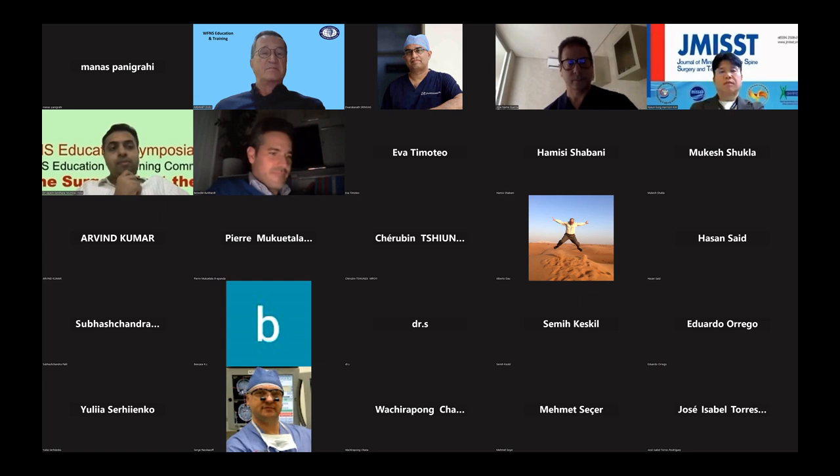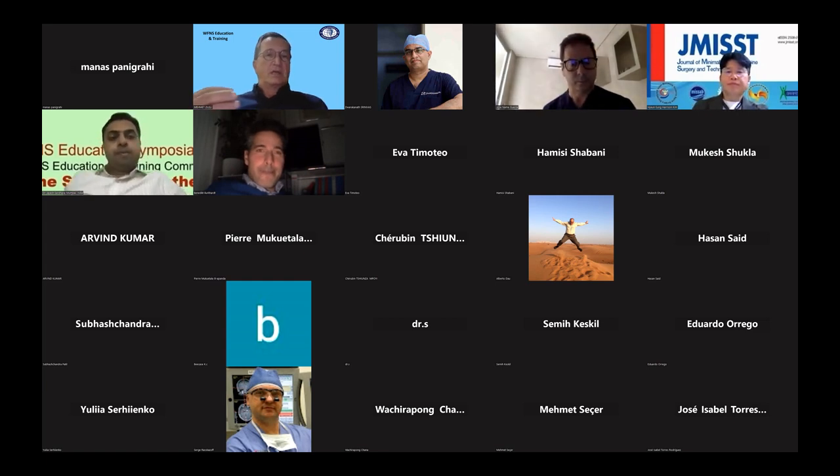I must mention that the drill bits used for this endoscopic surgery, for fusion or for compression, are very expensive. They are probably 1,500 euro, one tip only. Absolutely. And the basic instrument set is about $80,000 or $100,000.